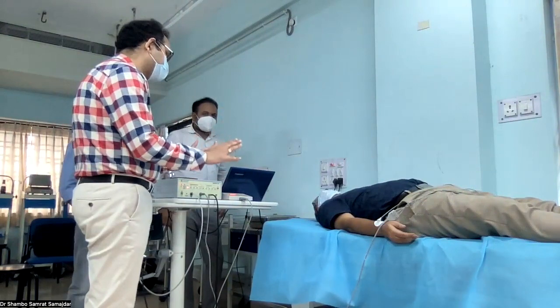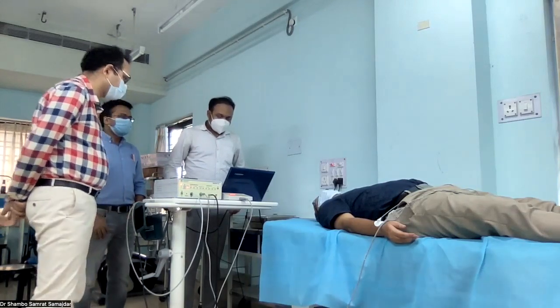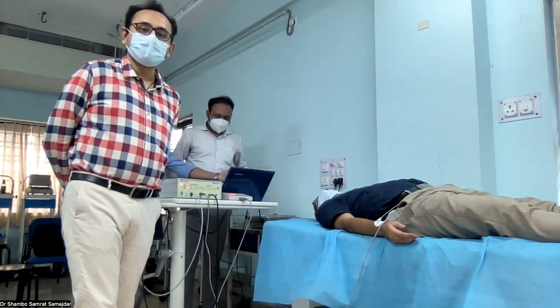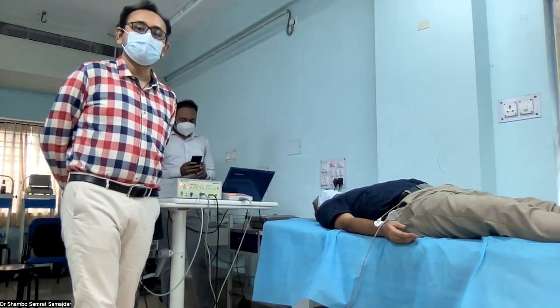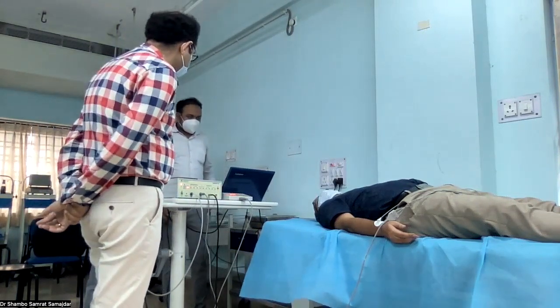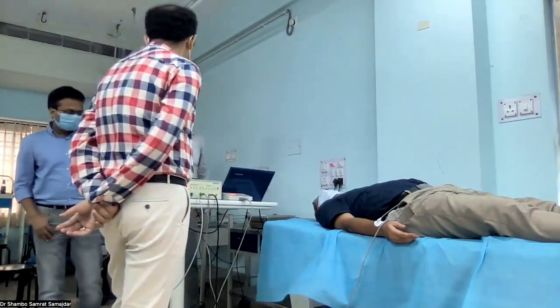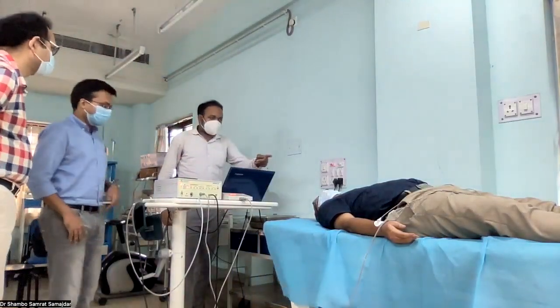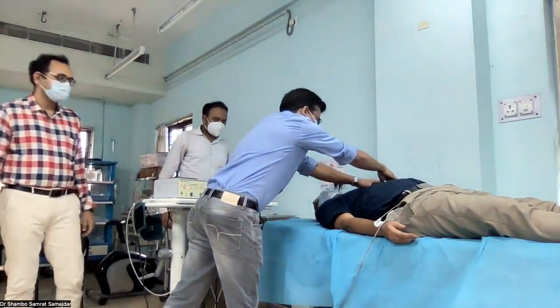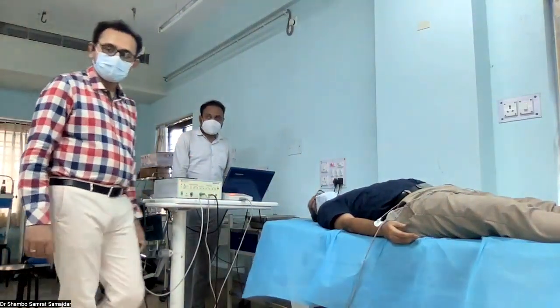You take normal inspiration and expiration. As we are privileged to have Dr. Jyotirmoy with us, sometimes we use medical terminologies, but it is better to use layman language when we are doing this type of test. So instead of inhalation or exhalation, we need to tell breathe in and breathe out. Mobiles and every metallic thing we need to remove before the testing.